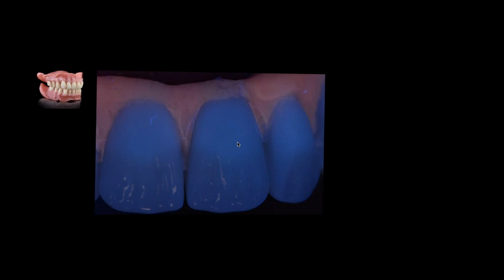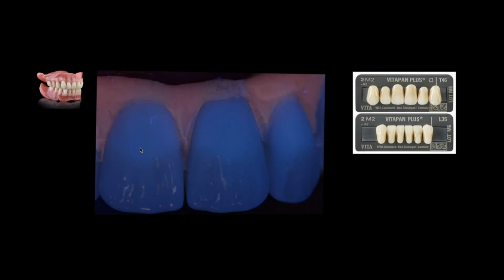And I don't mind working with denture teeth. I actually like them. I think I've pointed out in other webinars that a lot of the VITA denture teeth today are really aesthetically pleasing, and they have the right fluorescence and colorations in them. So that makes it better for us when we're working through the cases.